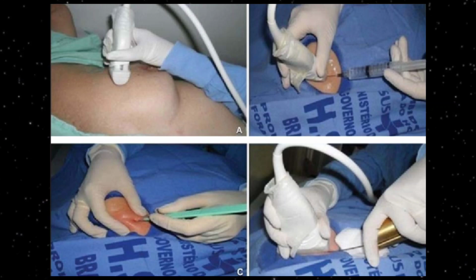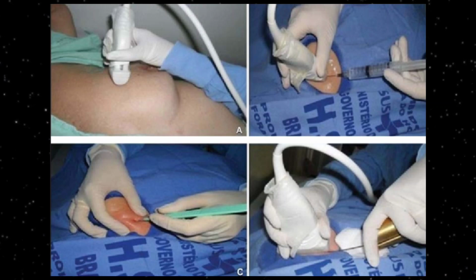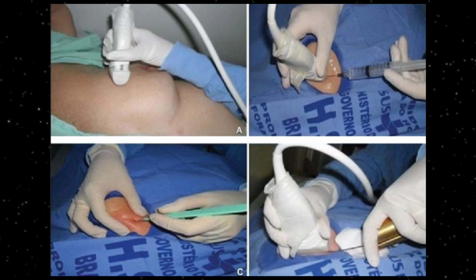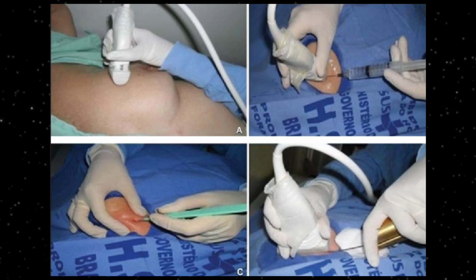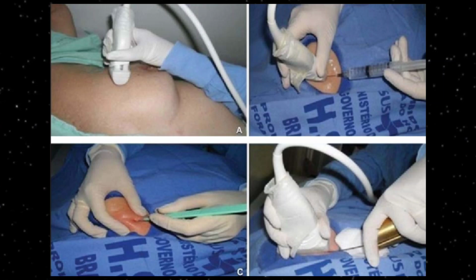When you put the probe on the lesion, you will be able to localize the lesion within the breast parenchyma and freeze it on the screen, seeing that the lesion is under your probe. The next step is to disinfect the area.